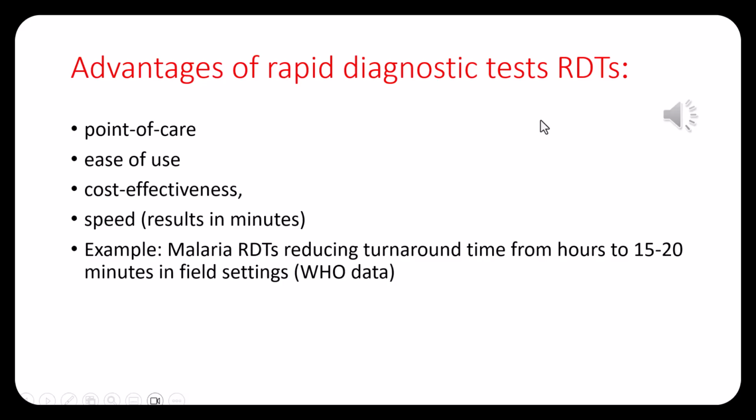The advantages of this test: we have the point of care. Point of care means the patient can do this test at home without going to any medical point, the laboratory, or the hospital. They can do it by themselves at home. That is what a point of care test means.